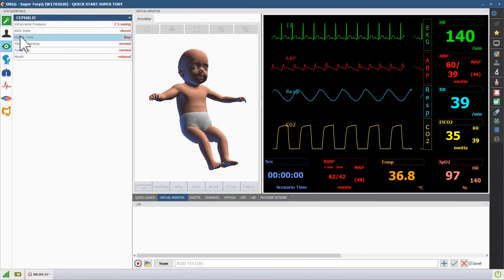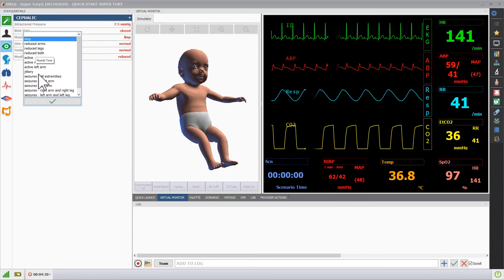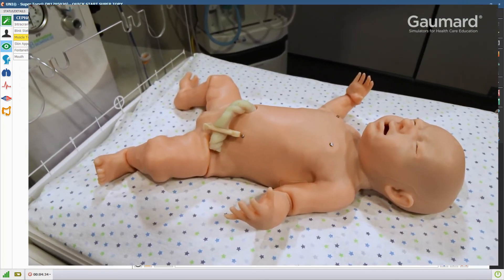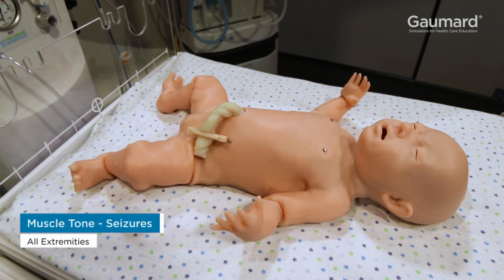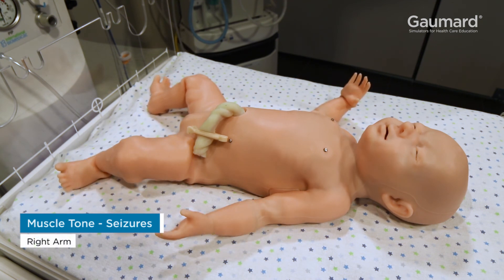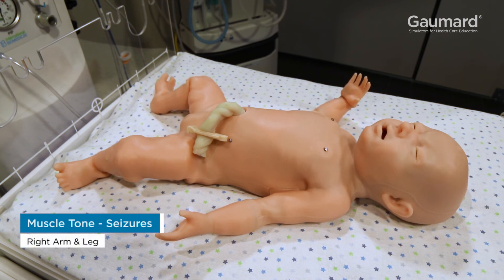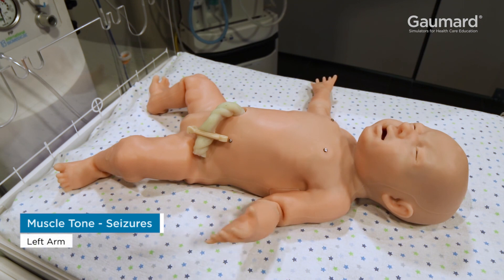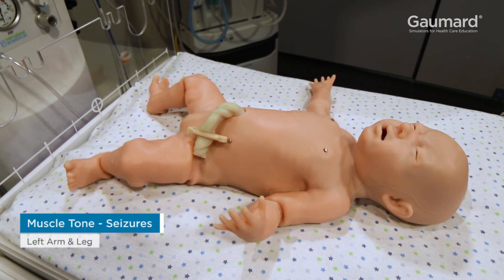Supertory also has a library of pre-programmed seizures in the muscle tone vital list. To present one, select any of the conditions with seizures.